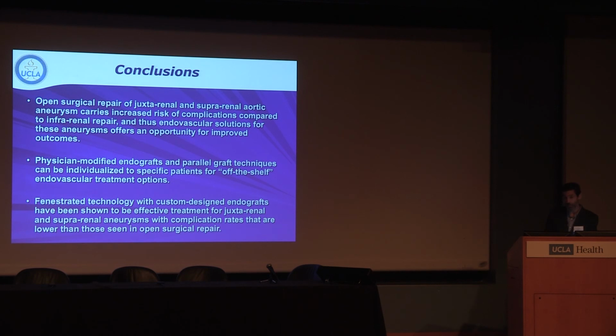Physician-modified endografts and these parallel limb technologies or techniques are useful because they can be individualized to the specific patient. They can be done with off-the-shelf devices without having to wait for a custom device, and they were our mainstay of treatment before having access to Gore.